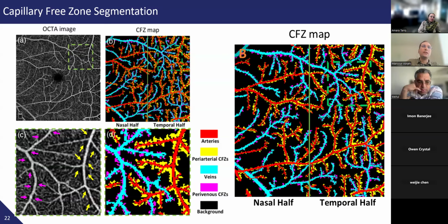Also, we have some general knowledge that most of the time arteries are above the veins, but generally we should check different B scans to be sure whether the artery is crossing over or the vein is crossing over. Mansour, is it because it's a 3D scan? You should have complete knowledge of what is crossing the other, what's over and what's under. Yeah. Oh, okay. Thank you. Thank you very much.